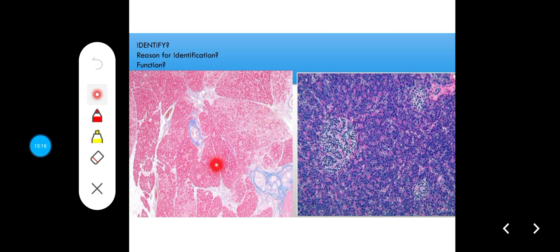While the exocrine part, which is the pancreatic acinar, stains very well due to the serous secretion that they release. So the endocrine part, which is the islet, does not stain well. Same thing here, you can appreciate it. This is the poorly staining patch.